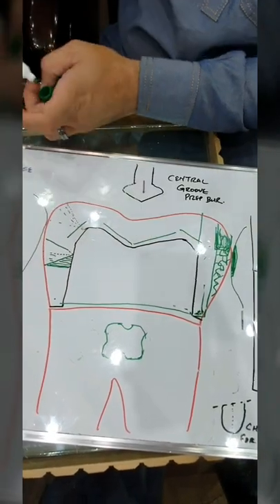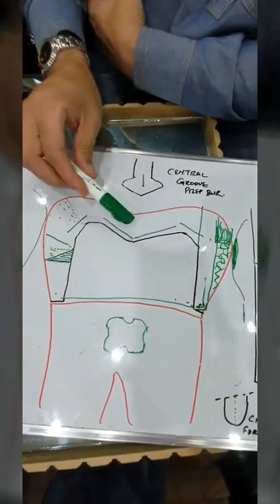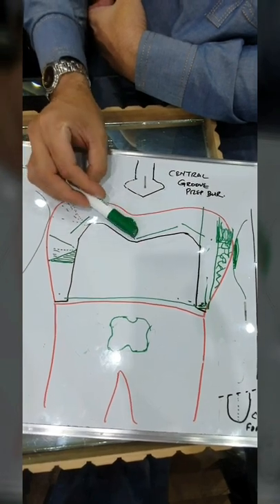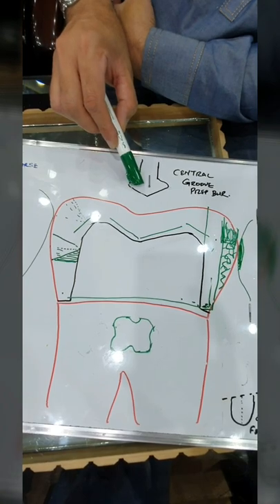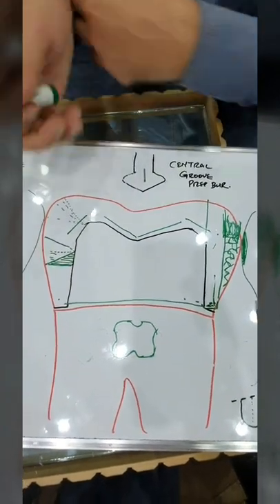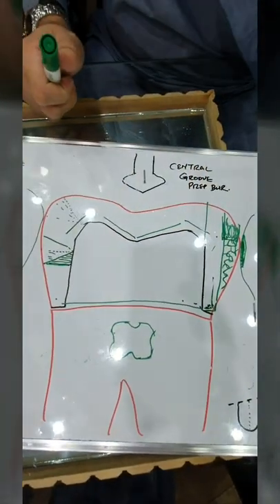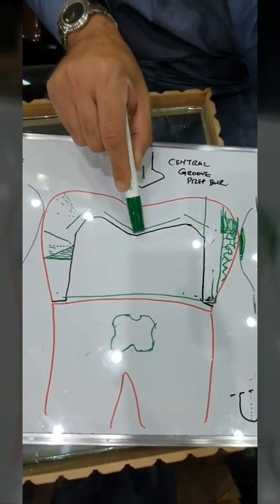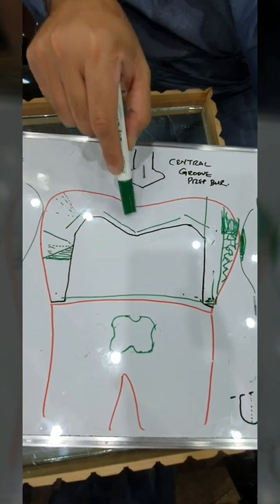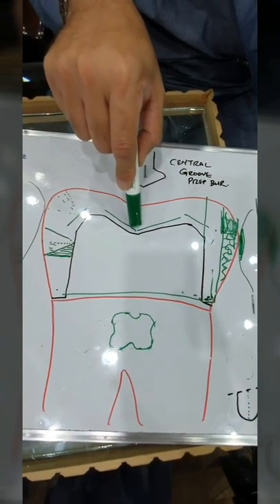Or you can use this same burr which was used for the margins, and you can cut one cusp and then the second cusp to make the central groove. But with this, I get a very nice central groove and a very nice flare all around. And doing this step ensures that when the crown is made, particularly in PFM, there is enough thickness on the occlusion for them to make the central grooves.